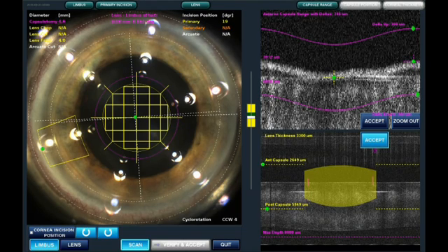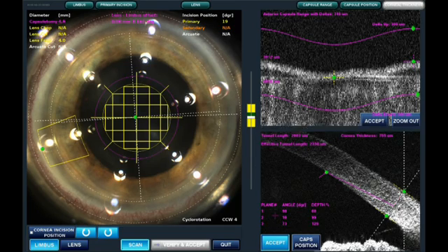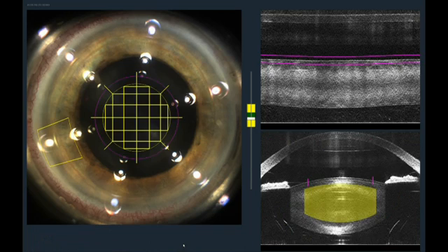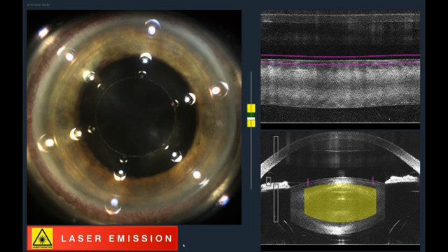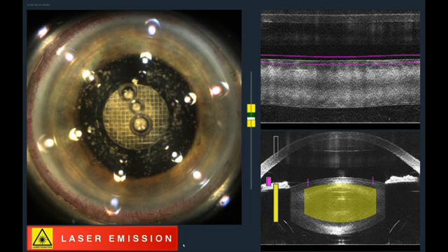Here we will now see the placement of the fragmentation — the capsulotomy as pre-placed with the Varion, very accurately. We have found that the Varion has made it much more efficient for us, not only in the surgical planning but also intraoperatively. Here we are going to begin the procedure. You can see the capsulotomy being done. We are using the grid pattern fragmentation for incision, arcs, fragmentation. Very efficient.